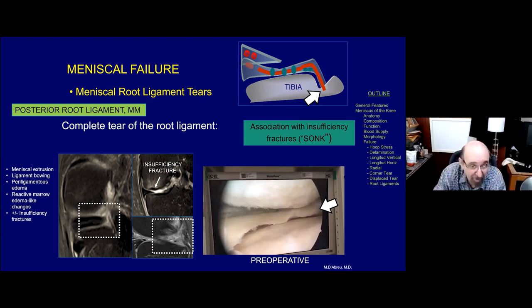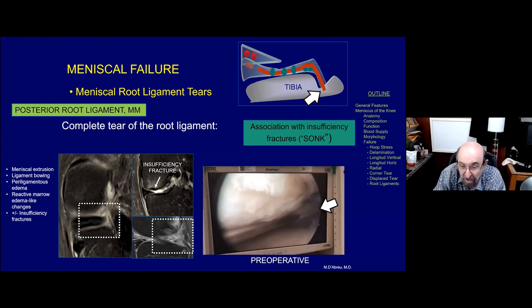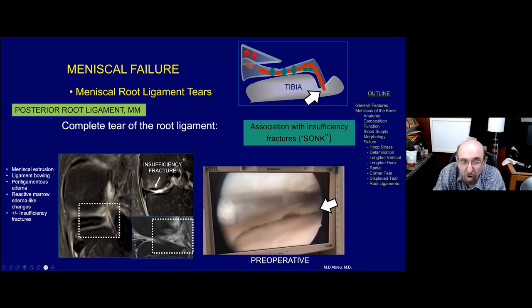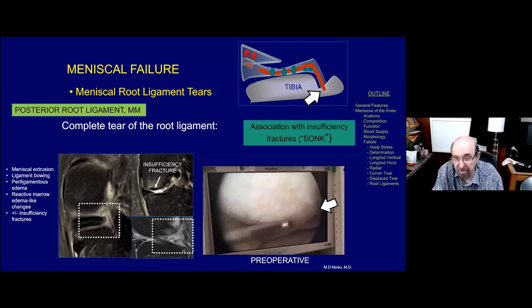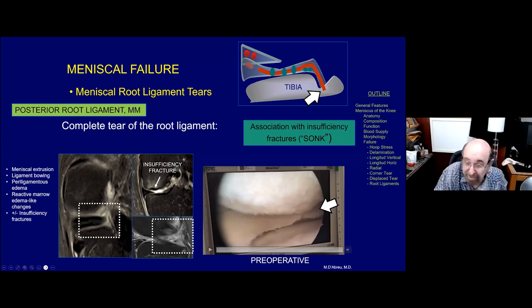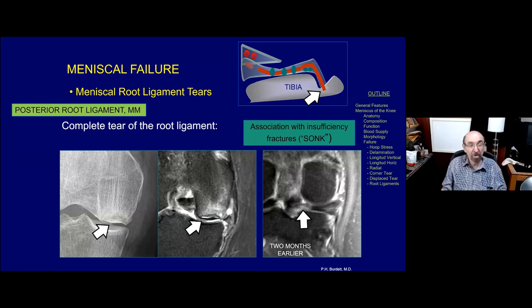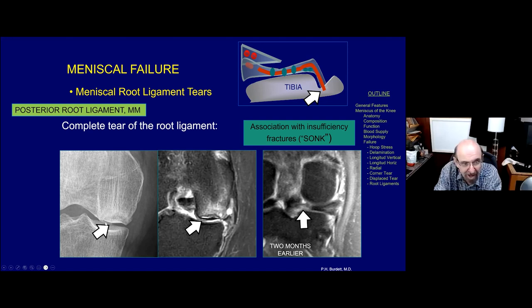Here's an example of a posterior root ligament avulsion with an insufficiency fracture - altered signal merging with the subchondral bone plate. Insufficiency fractures are seen with root ligament tears as well as radial tears in this location. What we used to call SONK, which we thought was osteonecrosis, we now recognize not as necrosis but as initial insufficiency fractures. Here's another example - classic SONK, what we used to call osteonecrosis of the femoral condyle. But this is an insufficiency fracture that has led to collapse of the subchondral bone plate. Two months earlier we can see the posterior root ligament avulsion with peripheral extrusion of the meniscus.